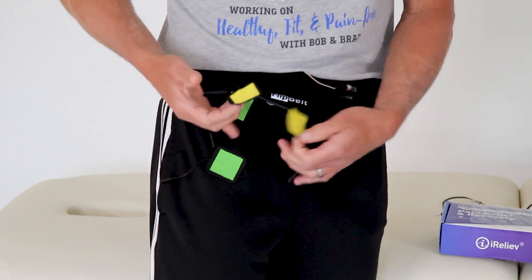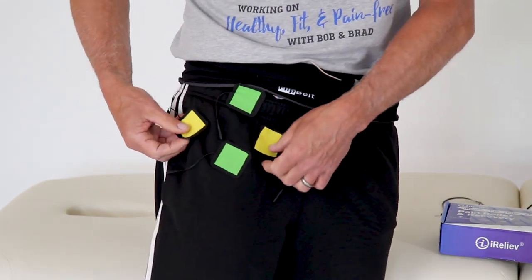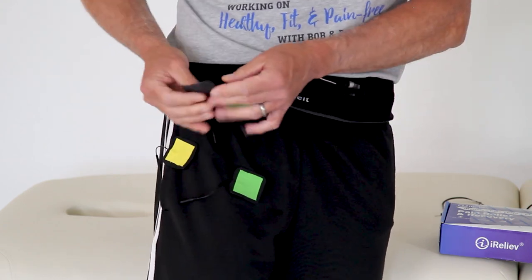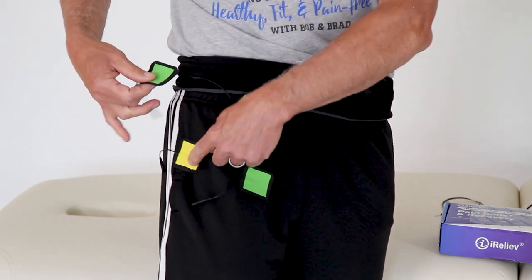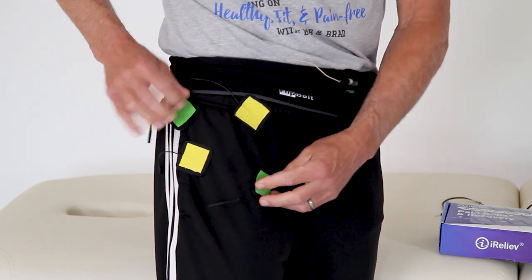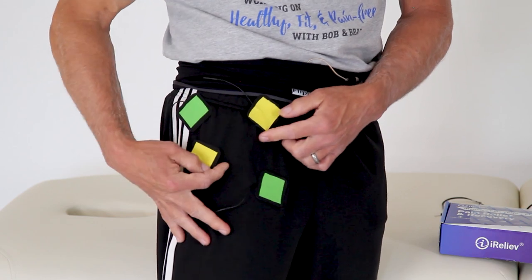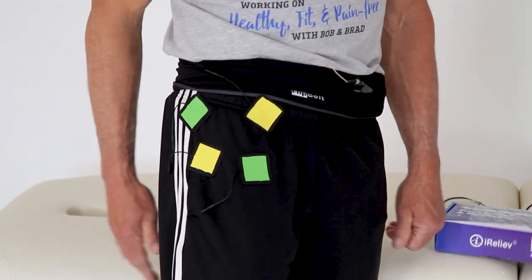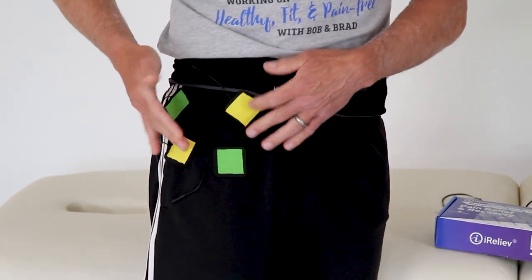Because of the femoral crease, you're limited. I could not do this because it's going to get in that bend. So I could go here, and I could shift it here. The current's going from channel one to channel one, yellow to yellow, green to green. So I'm going to go here and keep my distances. This one's getting kind of far away. You could try that and see how it goes. You may have to move it a little bit closer to get it in a formation like this. Now this one, it's close. You're going to have to see.